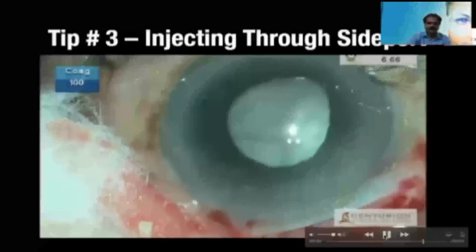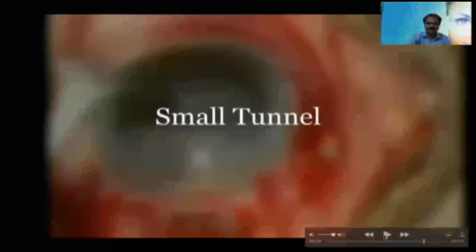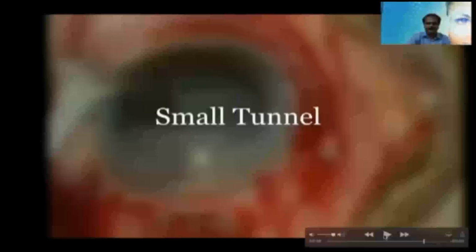So you can watch that the fluid is injected there. And now I'll show you certain case scenarios where the corneoscleral tunnel, though it appears normal, is fraught with complications.